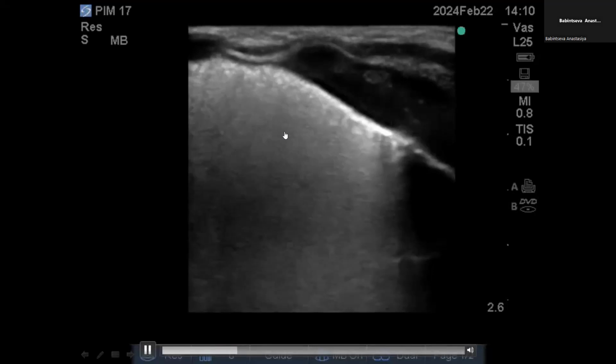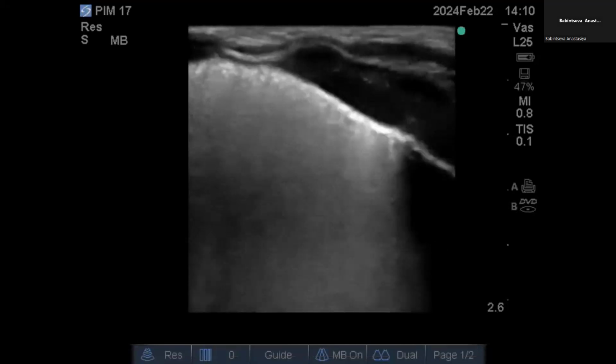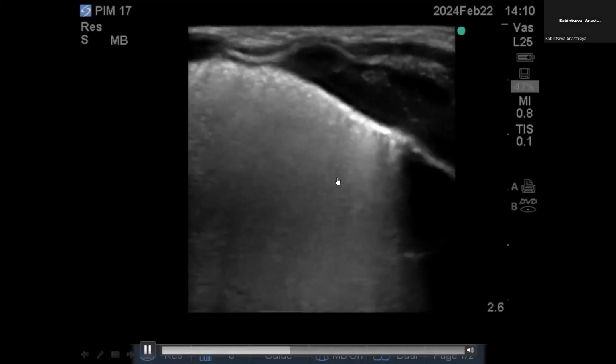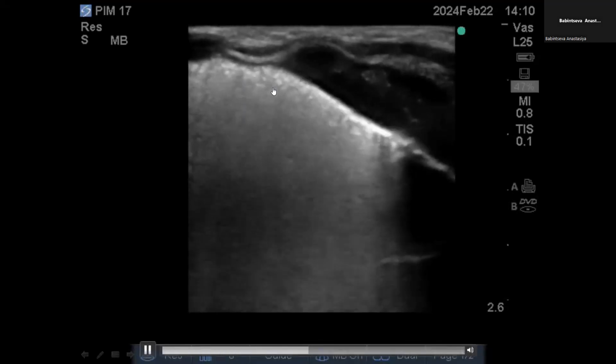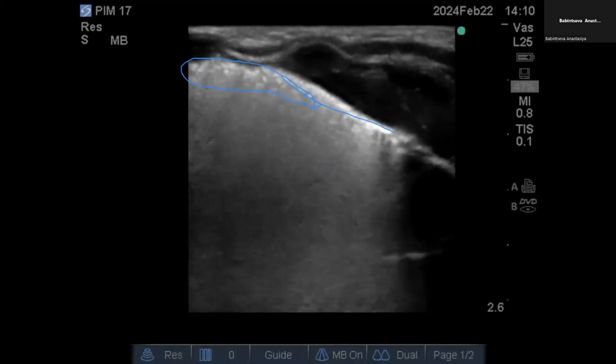Correct. Again, the reason you feel the pleura is that way is because you've zoomed in quite a lot. You need to zoom out and have a depth of about 3.5. But yeah, you can just see. Again, this is a snowflake appearance on the left side over here. And the pleural line is better established here, naturally, because maybe this area has worse surfactant deficiency and hyaline membrane disease. But yeah, you're right.